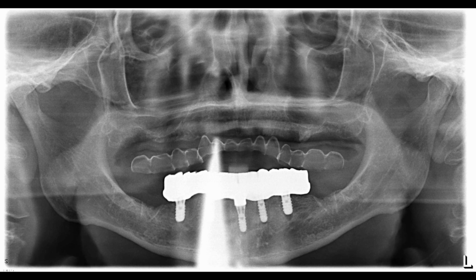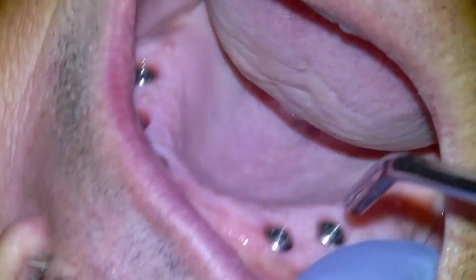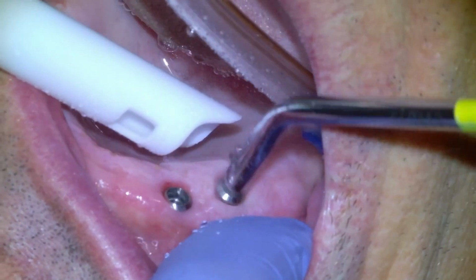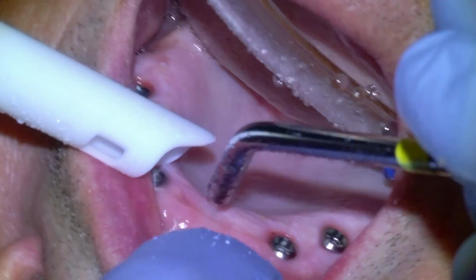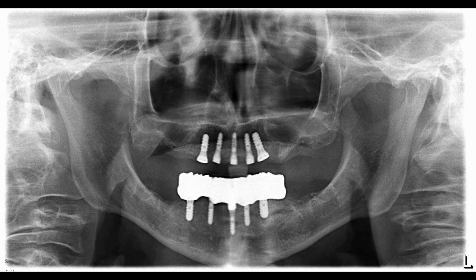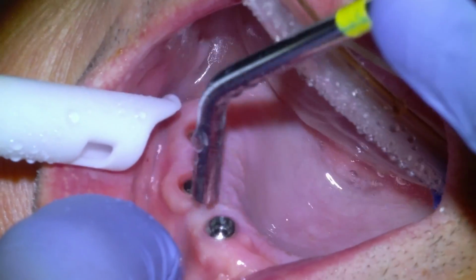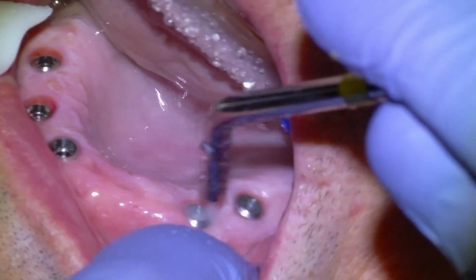Here's an x-ray showing the lower implant bridge and the upper denture. The patient liked the lower implant bridge so much that they said, hey, I want to get rid of the stupid denture. So we ended up putting 5 implants into the jawbone about 4 months prior to this appointment, and then making this upper implant bridge. Here's an x-ray showing the implants after the surgery, and then we design our implant bridge, which I'll show you shortly.